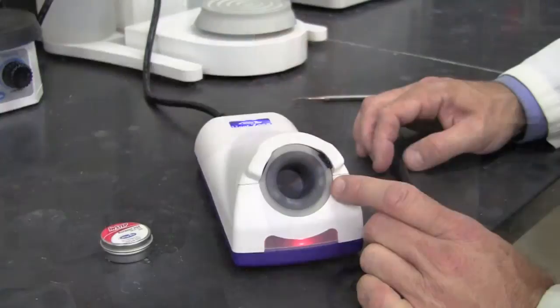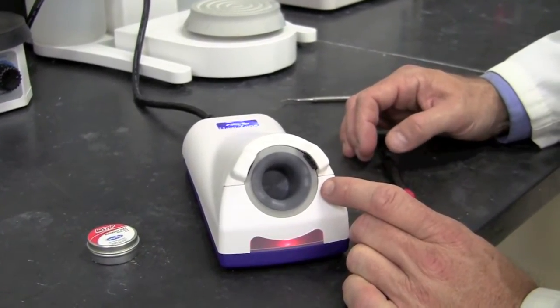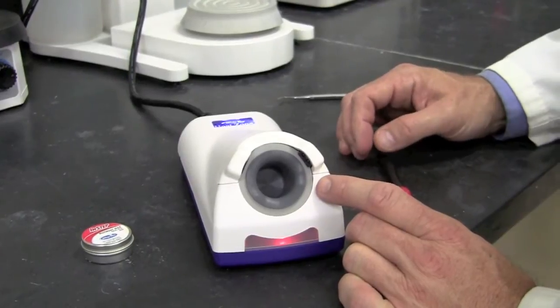Occasionally when the unit is first turned on, the light might not show solid green. It might flicker red to green or show a solid red. As you can see this unit is flickering green to red without an instrument being inserted, which means it will require some adjustment.